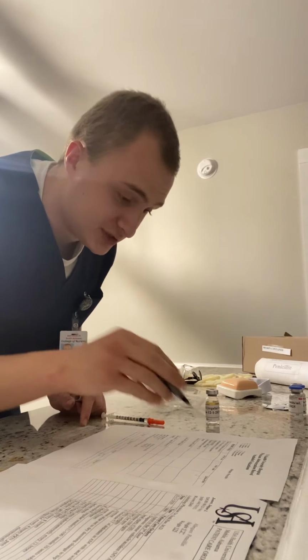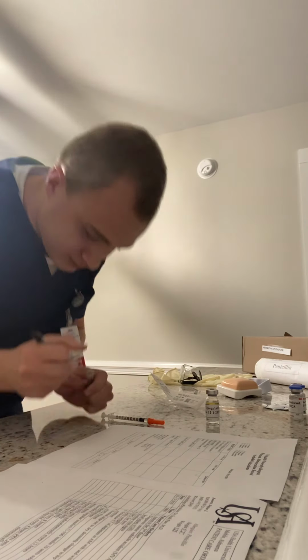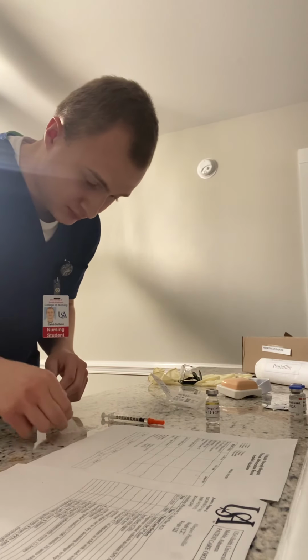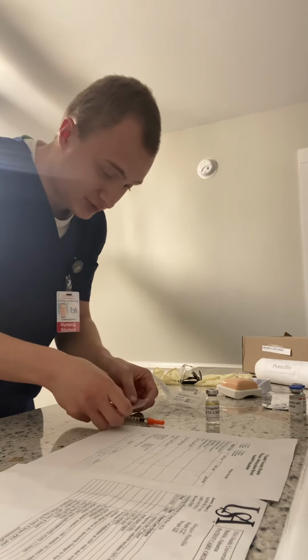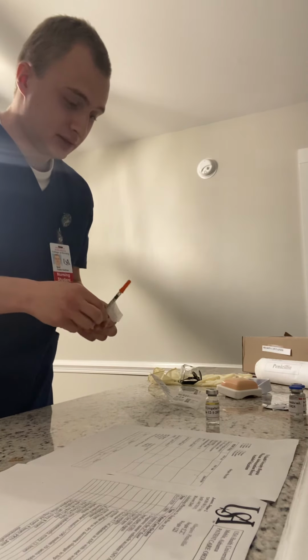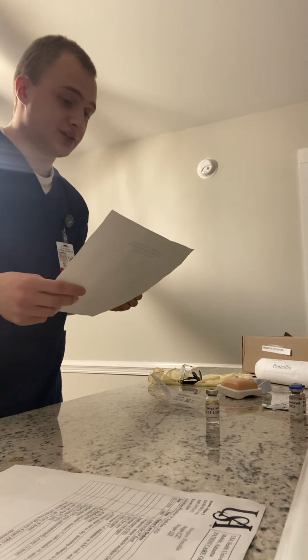And the right dose, which is 10 units. Now we'll administer this to the syringe. And now at this time, I will proceed to the patient's room with my syringe and my MAR.